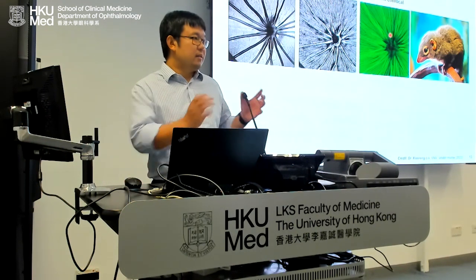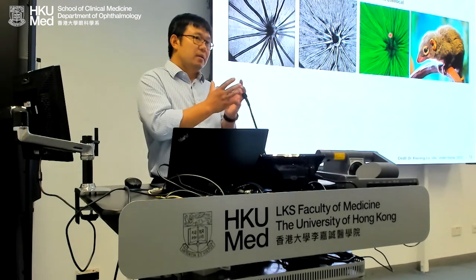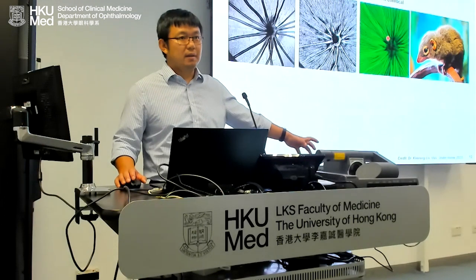And here is a sacrificed eye, the same eye, sacrificed, put on the microscope, stained, and then we're able to almost match fiber to fiber. So that's the histological validation, because we have to do it.